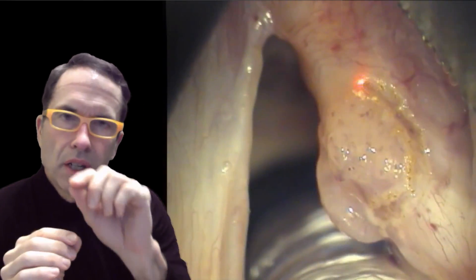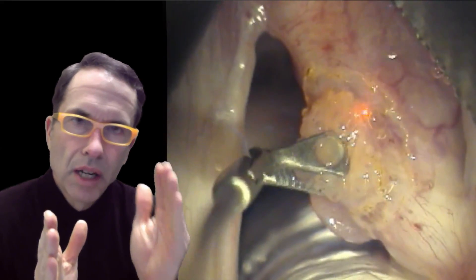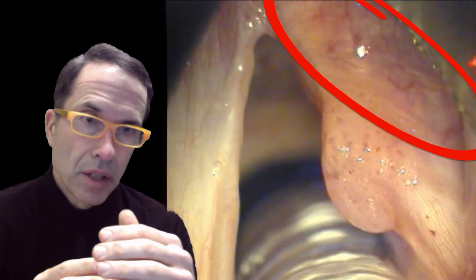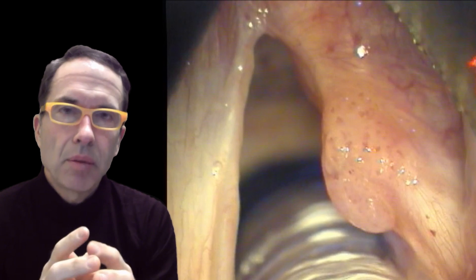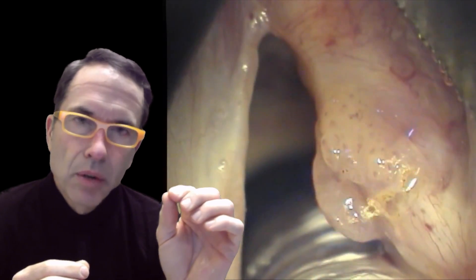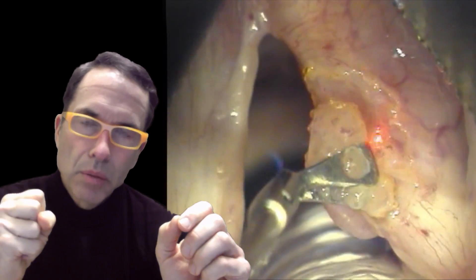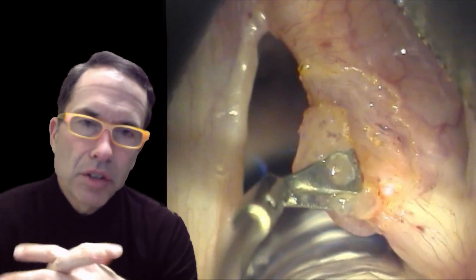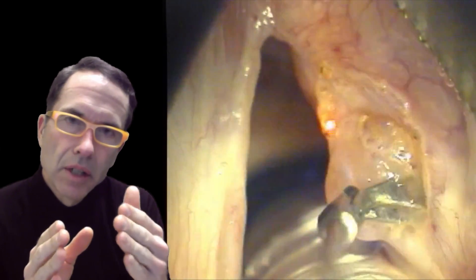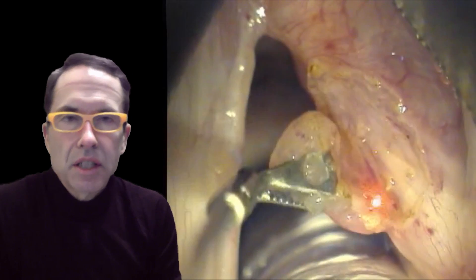My goal here is to cut around the margin — cutting on normal tissue right at the junction between tumor and normal tissue. You can see that the side I'm working on had previous surgery; there are ectatic or curved capillaries compared to the other side, and that's scar tissue. Now I'm going to cut, getting through the mucosa first, then grab the tumor and pull it away, adding tension to it, cutting right on this margin. Where I'm cutting are little fibers that just pull apart as I excise the tumor.